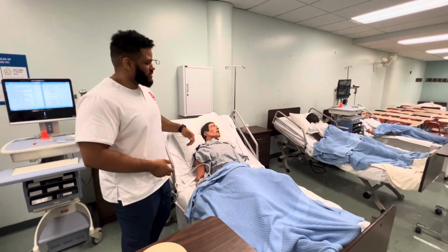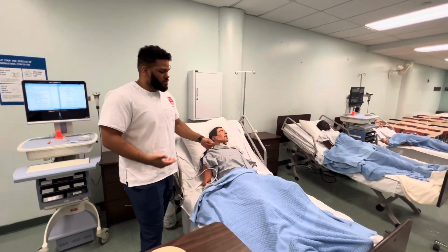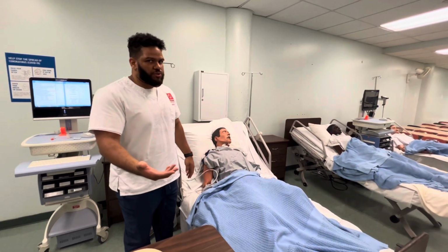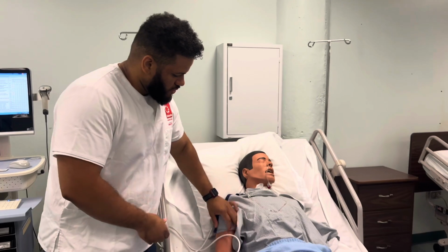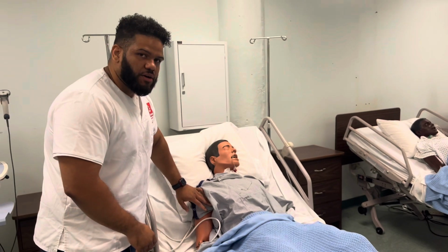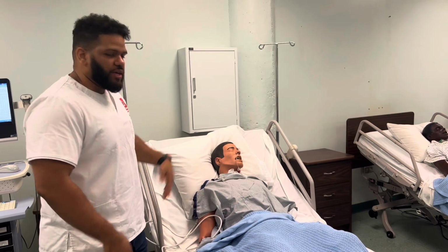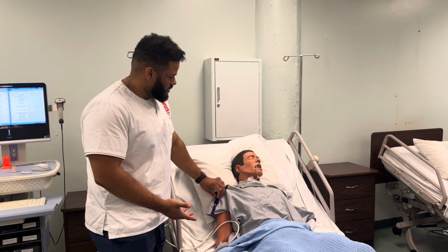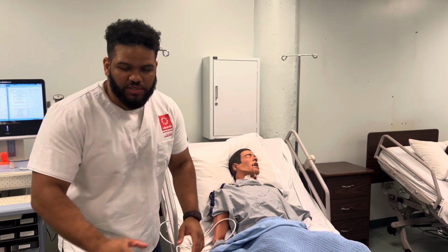From here, another thing that we start doing is verifying or deciding where to give the injection. I like to make the patient a part of this. So I'll ask them, hey, is there any particular place where you want the injection? So for the subcutaneous layer, there are a couple places where you normally get this. This could be under the arm here for the fat tissue, right? So on the arm, on the underarms here, and the leg. Most common is the arm. However, the fastest absorption rate would be the stomach. But yeah, you want to make them a part of that, right? So you ask them, is there any particular location you would like your injections today, Miss Newlywed? I would like the arm. Okay, perfect.